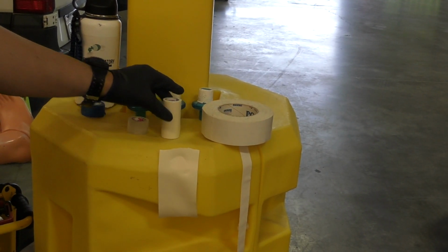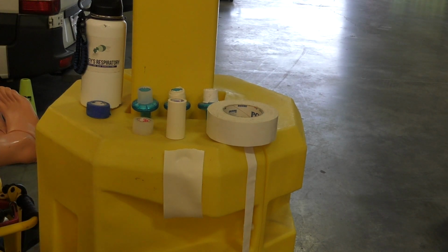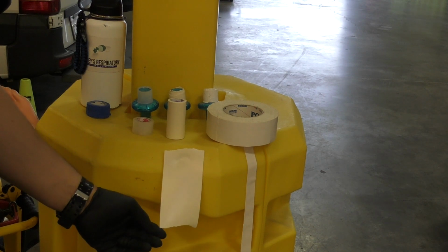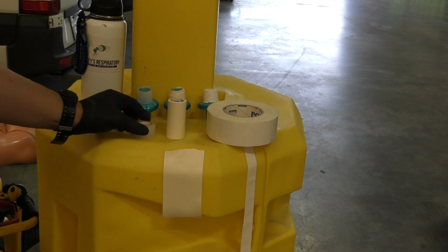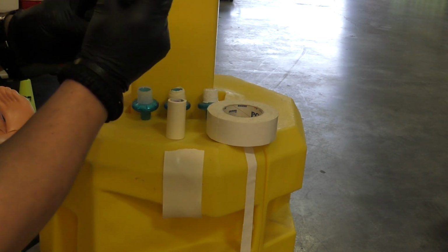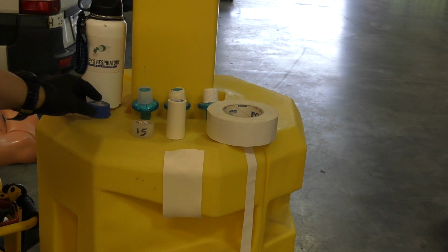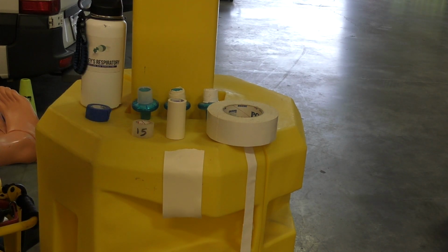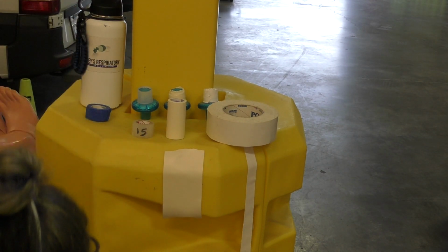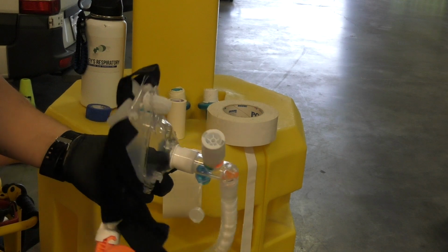So we have a filter made with each type of tape. We have the duct tape, and as a visual, just to show you how much we need for it, about 3 feet, about a meter. For the foam tape, we need about a dollar size length, and for our clear tape, you want to wrap it 15 times around. Now, what about the Coban? This is useless. Don't even think about using this. But you've got other tapes to use as a makeshift filter pack for these types of medic CPAP devices, the GoPAPs.